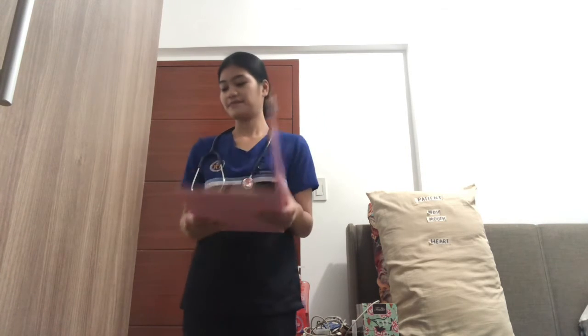So, as I can see in the doctor's order, Mr. De La Cruz is scheduled to nebulize at this time with the medication of salbutamol, every 6 hours. So, in reviewing the patient's chart, patient name is James De La Cruz, age 65 years old, sex male, and room or ward number 101.